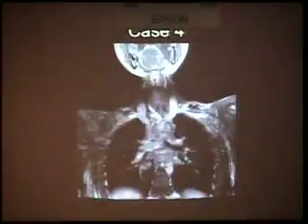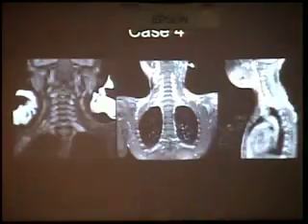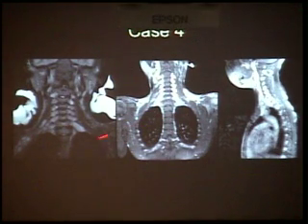These movies go a lot faster, but you can kind of see them coming into this one here. You know there's something abnormal there. These still images are better. So you've got all these rope-like enhancing masses coming out, all the neuroforamina. This is neurofibromatosis.